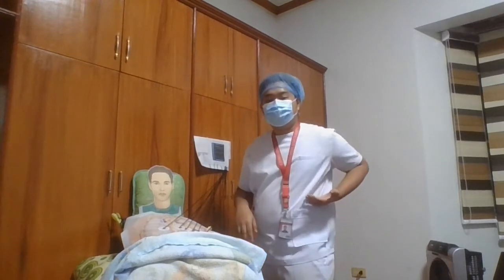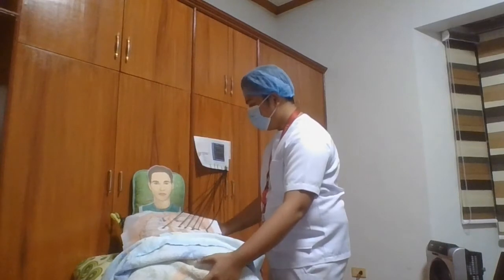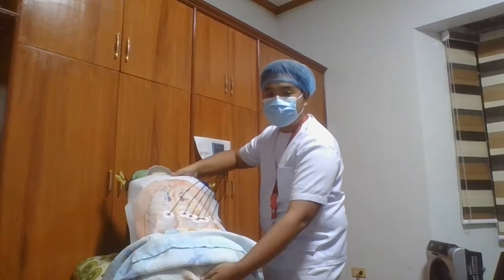V6 is placed more on the side of the patient. So that is our ECG placement.